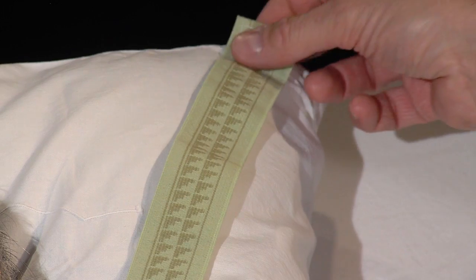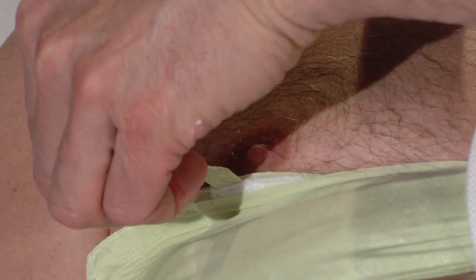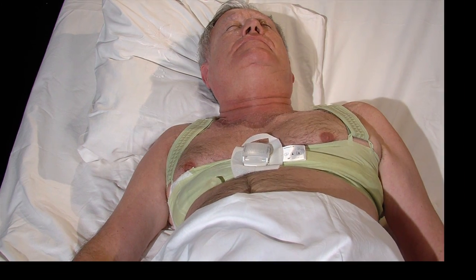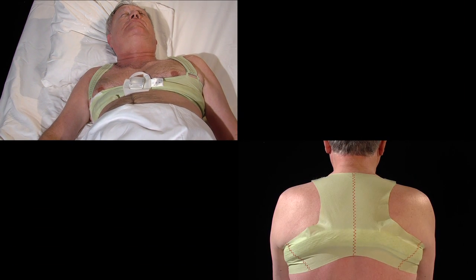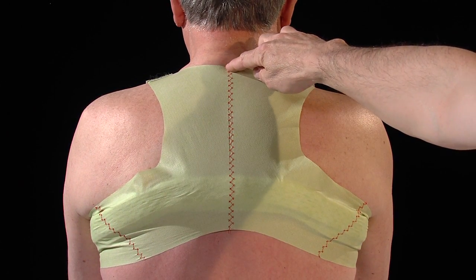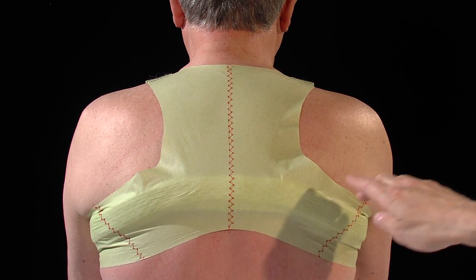As an alternative, use the lateral loops. Now the sensor belt should fit symmetrically. Looking at the back, the midline follows the spine from C7 on downward. The sensor belt surrounds the chest just below the armpits and breasts.